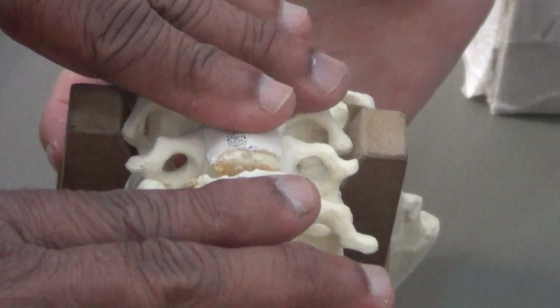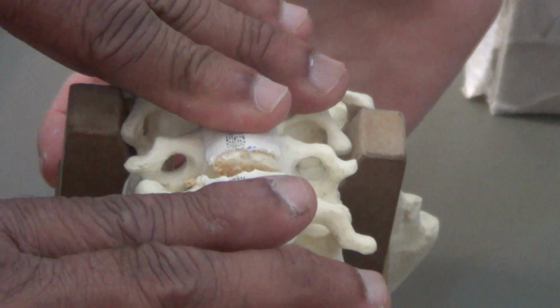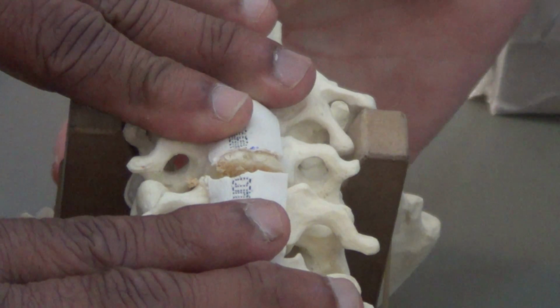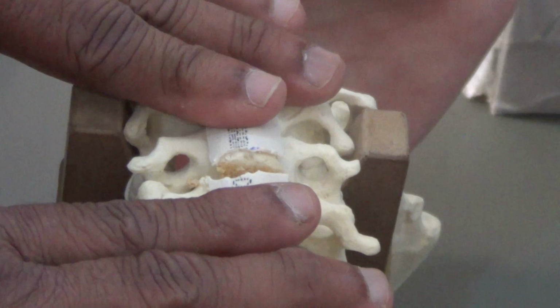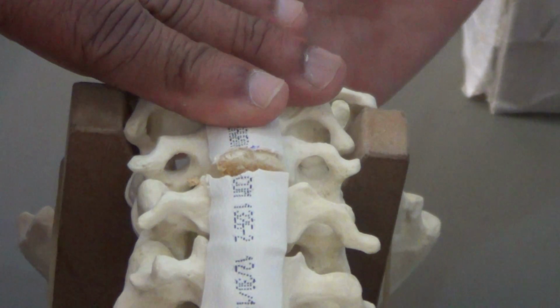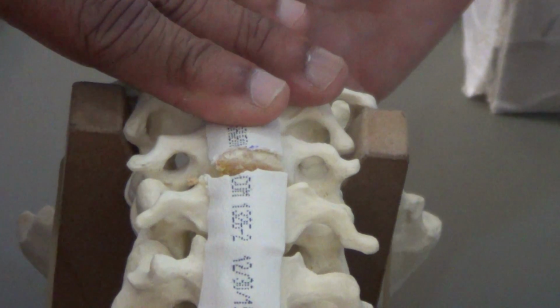Once you know there is complete decompression, the next thing that we have to do is to stabilize the spine. Now, how do you stabilize the spine? You can either take a tricortical bone graft from the iliac crest. You can do that.